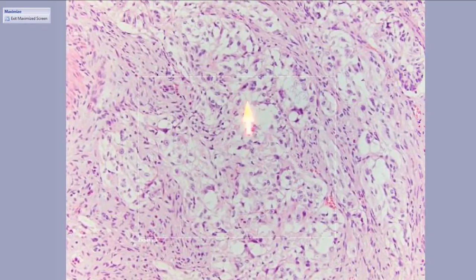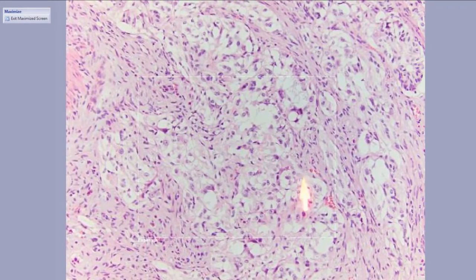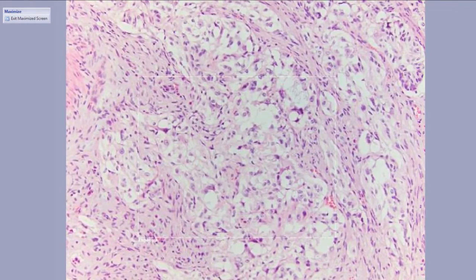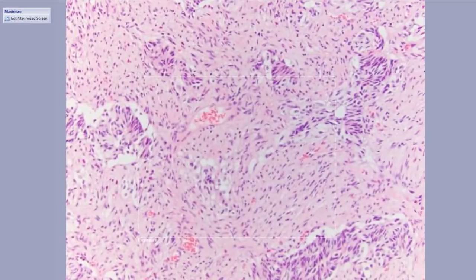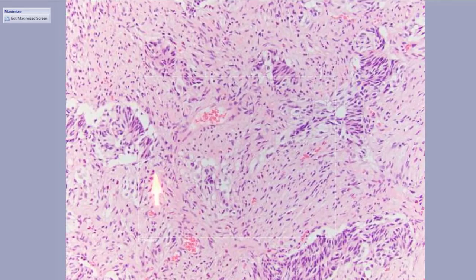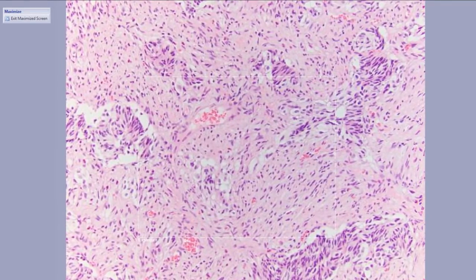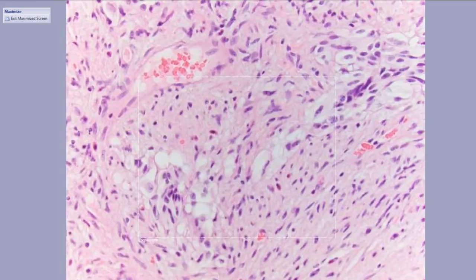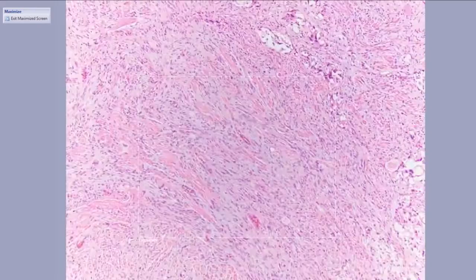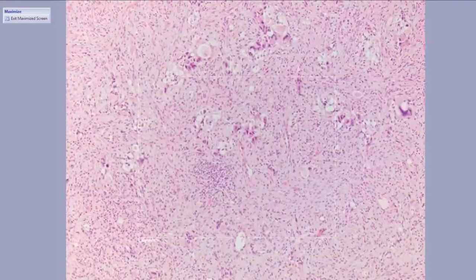You've got these areas with maybe more epithelioid cells, kind of loose. Then you've got this background, there's more epithelioid. There's also a spindly component kind of supporting it in the background. Looks bland overall. And then if you look around, you can actually see these very large, rounded, almost ganglion-looking cells. There's the other area has some better ones.